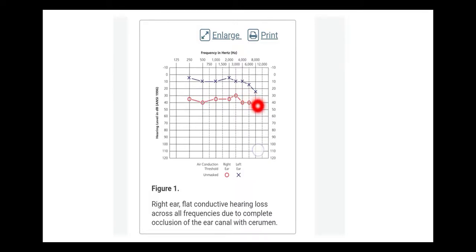In this ear there is a flat conductive hearing loss across all frequencies, and this is due to a complete occlusion of the ear canal. This could be because of a foreign body or cerumen - a complete mechanical blockage of the outer canal resulting in a flat conductive hearing loss.